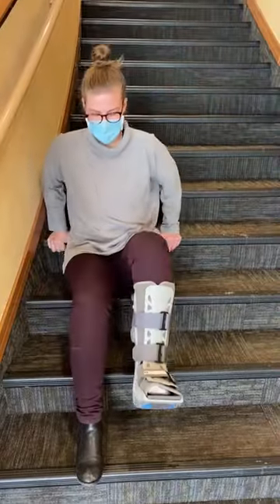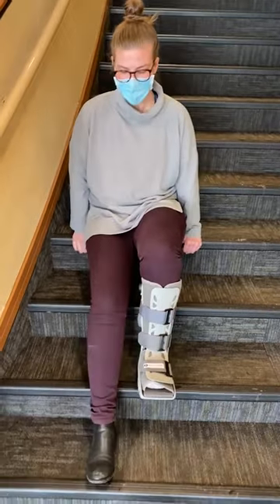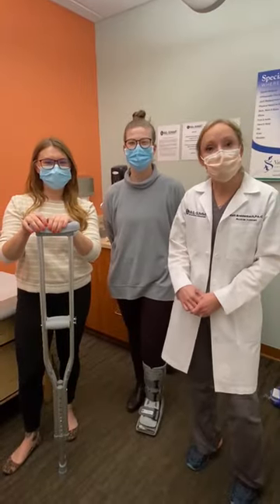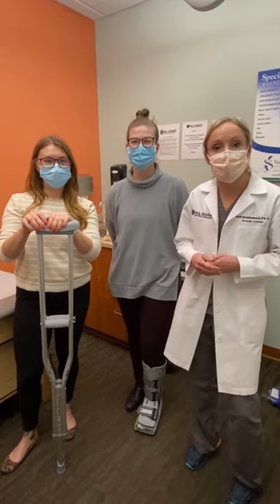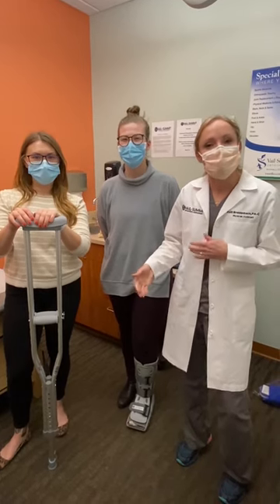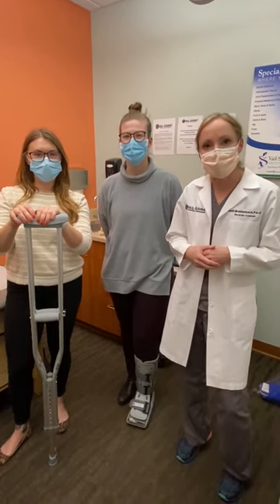Remember to take your time, and if you still do not feel comfortable, you can employ the scoot method. As you become more comfortable, you will gradually progress the amount of weight you place on the leg and gently remove that pressure from the crutches. This generally takes about a one to two week time frame.